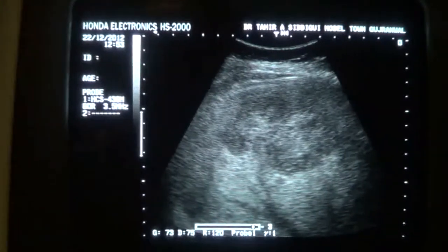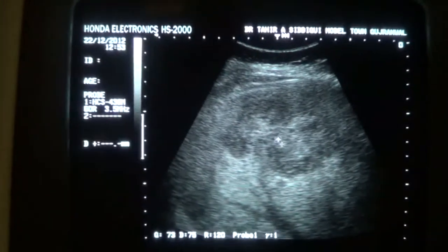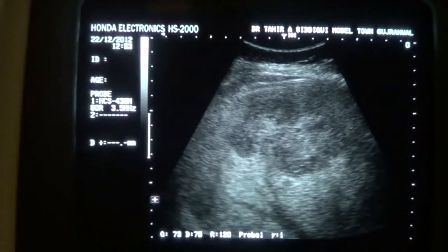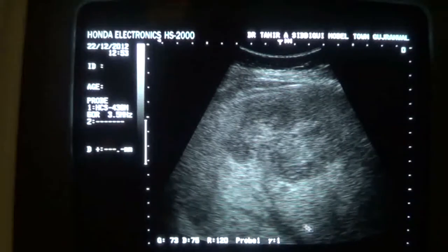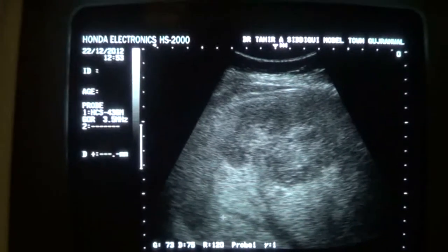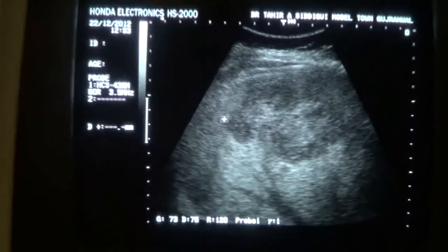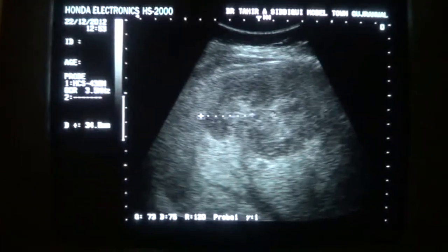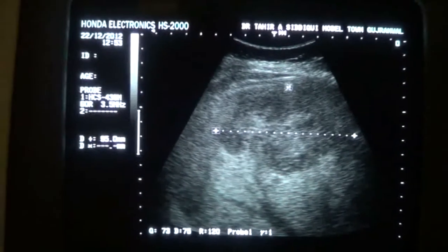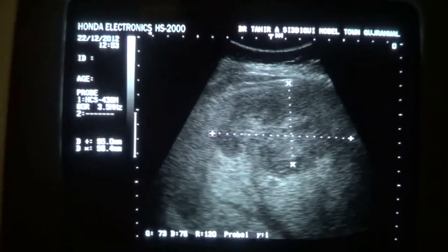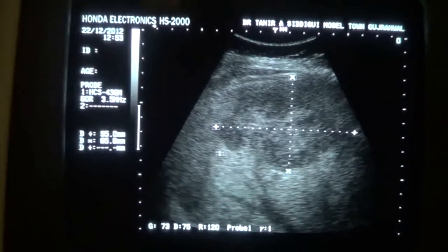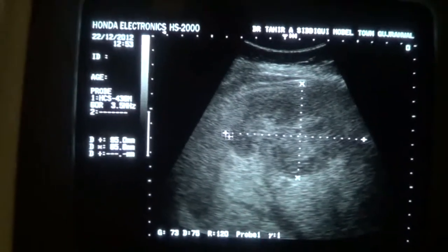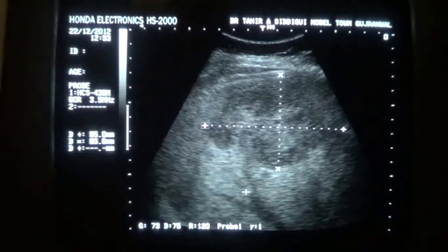You see this area. Now this is the fatty liver. You can see fat. See the blurriness of the vessel margins, which are consistent with the fatty liver changes. This area that appears to be a mass is not a mass — it is a focal fat spared area in the fatty liver.